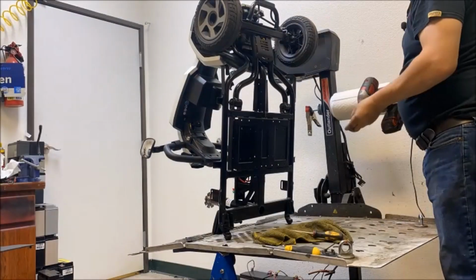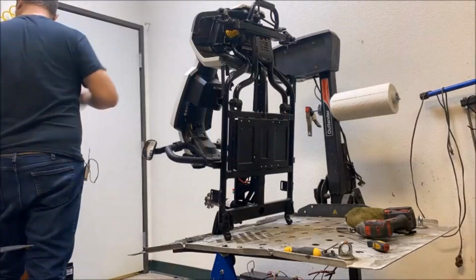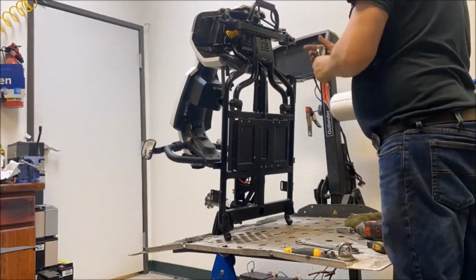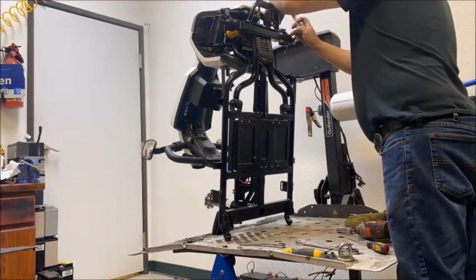On some scooters, not all, front wheels usually have a locking washer that holds the bolt in place, but I always double up, put Loctite on, double check it, just make sure it doesn't back off. You don't want any wheels falling off.